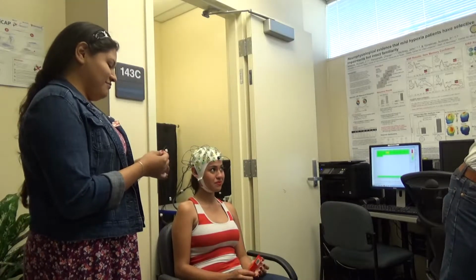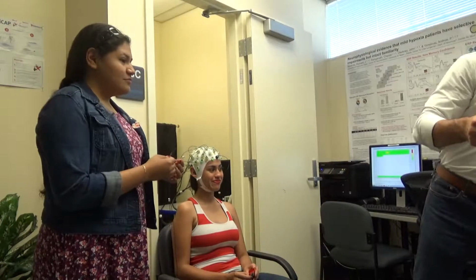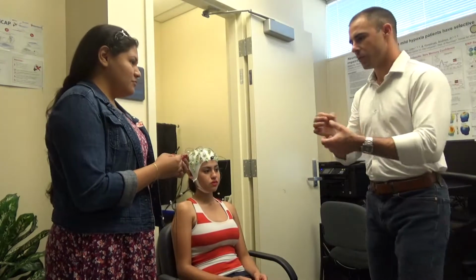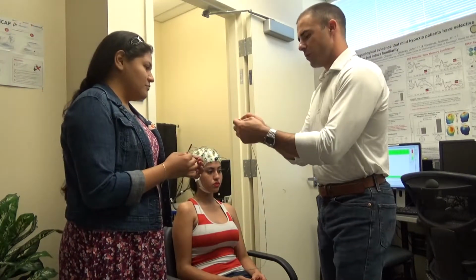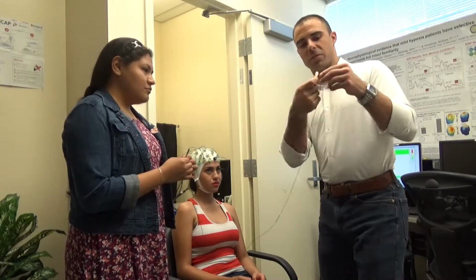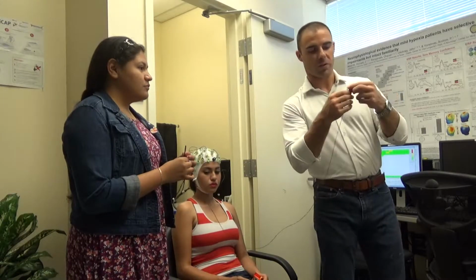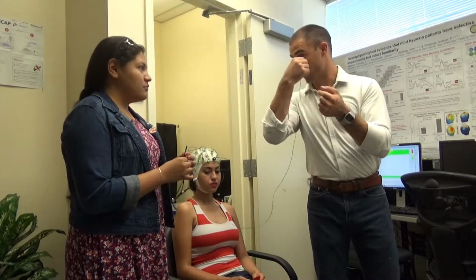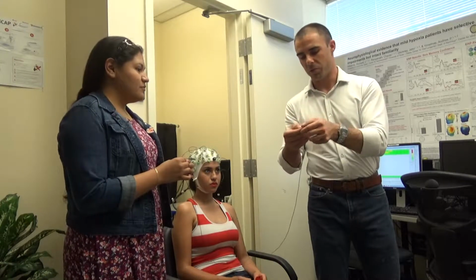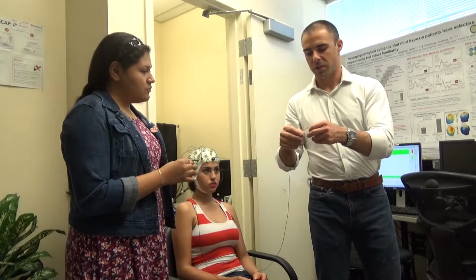Okay, so what we do is we use these little stickers. Take one of these. The first thing that we can do is we first stick it to here. Now you want the blue little tip on the bottom to be in line on the bottom end of the wire. Okay, this way it'll sit downwards. You don't want it where this little tab part comes closer to the eye or gets distracting. And then you just pull off the back second end of the two-sided tape, and now it's ready to be stuck.